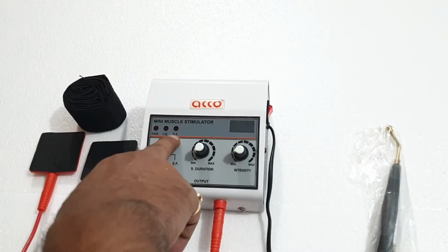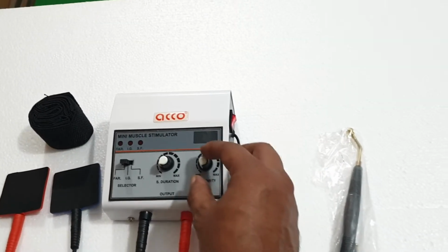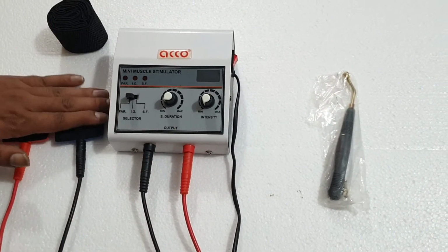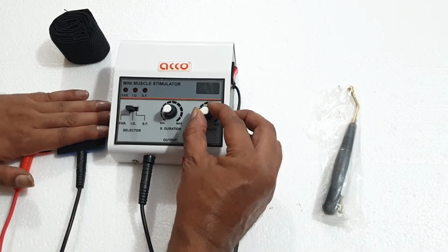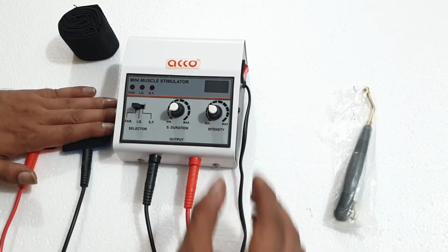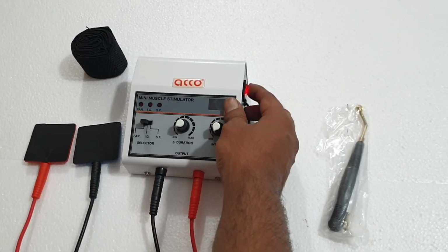As we are showing you a demo on interrupted galvanic, we will just place the pads as per the requirement, and then we will increase the intensity. Place the pads as per your requirement and then increase the intensity as per your requirement. Once the treatment is completed, make the intensity knob at 0 and switch off the machine.